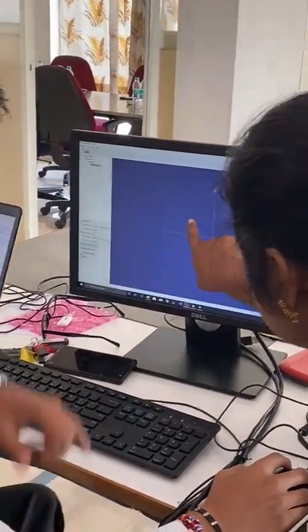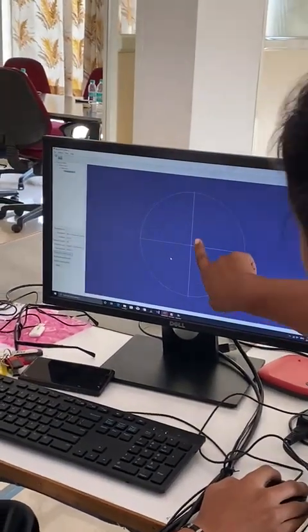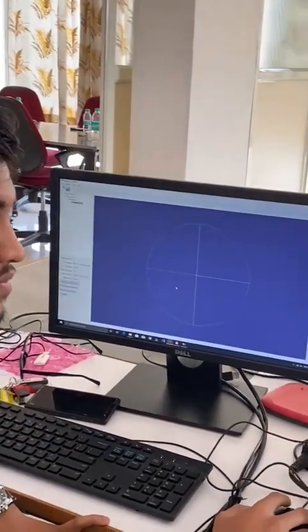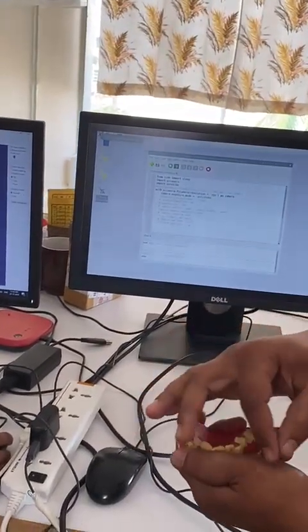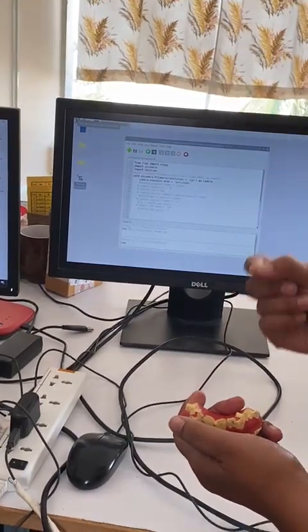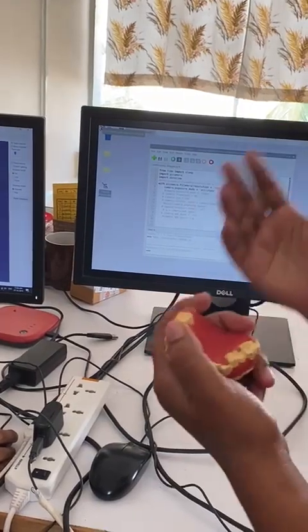So here you can see the sparse triangulation dots that have got created right now. This is only a point where the triangulation can start. For example, this arch has a point over here, a high point, a low point, and a depth point. So it is not a complete arch right now. It has only created discrete points. So right now we are going to create a dense cloud around it.